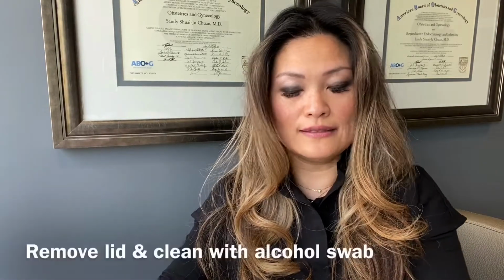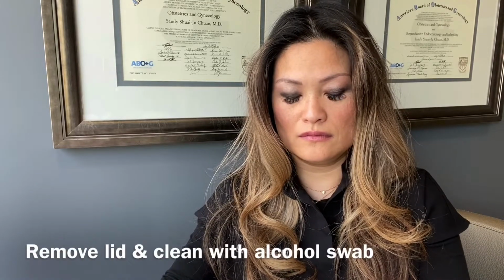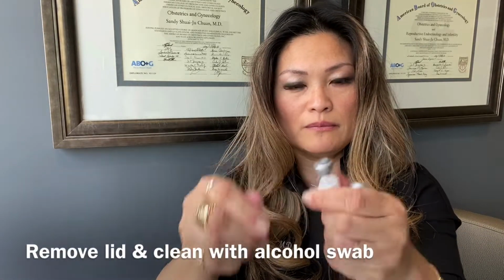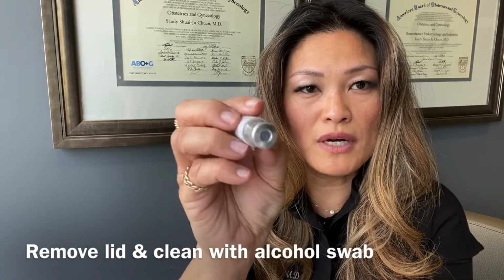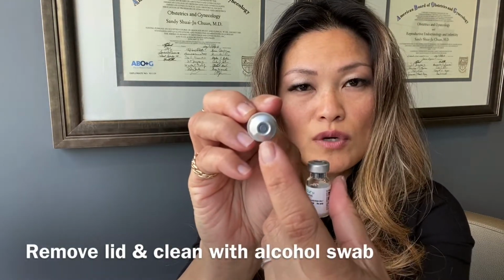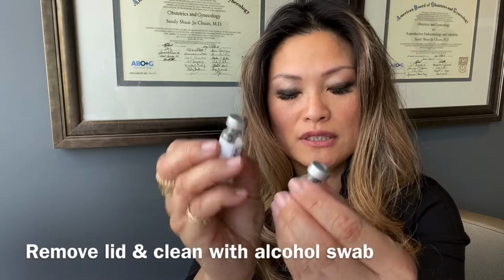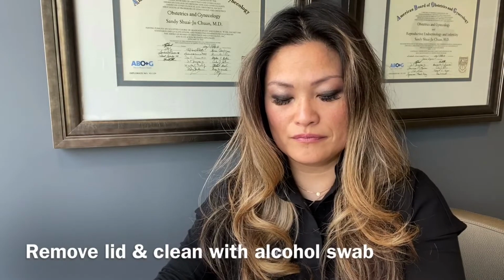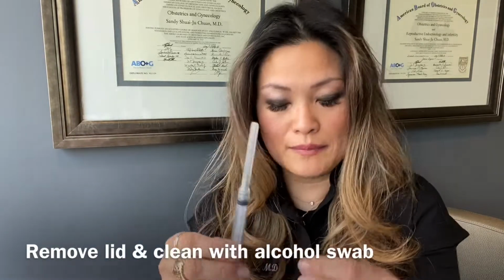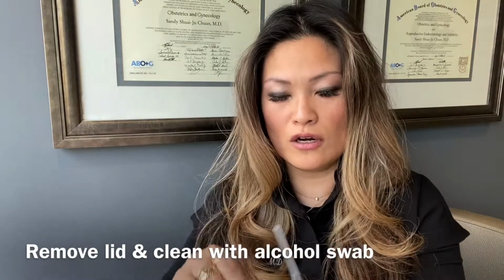And so what you want to do is, I always tell everybody to pop the lid off first. So I pop the lid off everything. So here's my saline. You could just set that down and pop open my Menopur. So you will see that this is my Menopur. Once you pop the lid off, you see how it has the little rubber stop area, and that's where you want to put the needle in. So what I do first, I set these down on my table, and then I take my needle. I also have my alcohol swab.